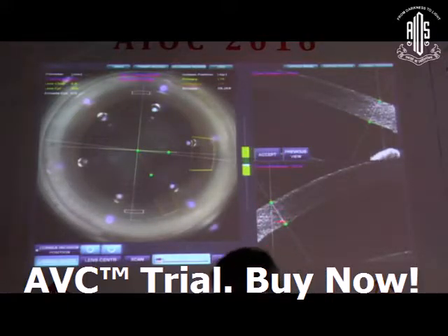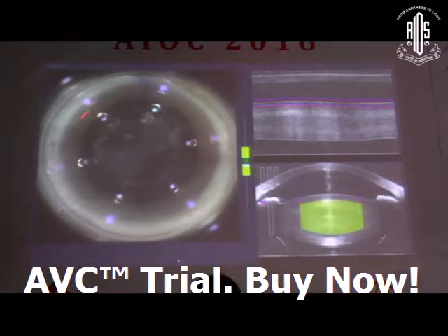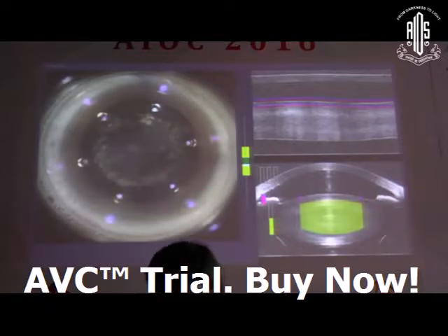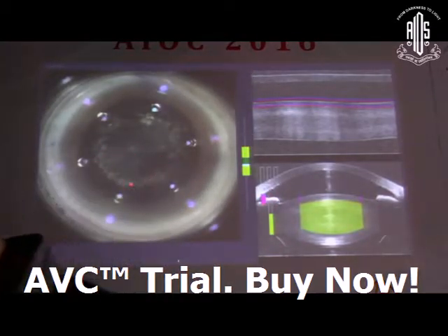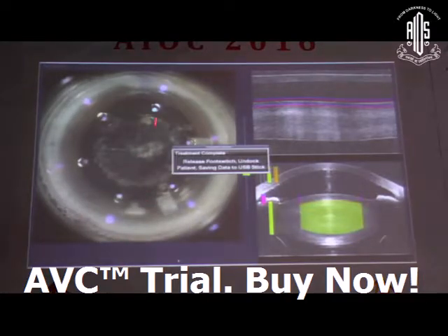Now once you have everything set, you just press, and this is the capsulotomy that has happened. You can see that this is the simplest, most old, I would say, divide and conquer technique which is happening. The yellow bar is showing you the nucleotomy that is happening, and it keeps coming from below upwards. You can see that this is a 4-quadrant crack that one has been able to establish. This is the primary incision, and this is the secondary incision. These were the two arcuates that you see.